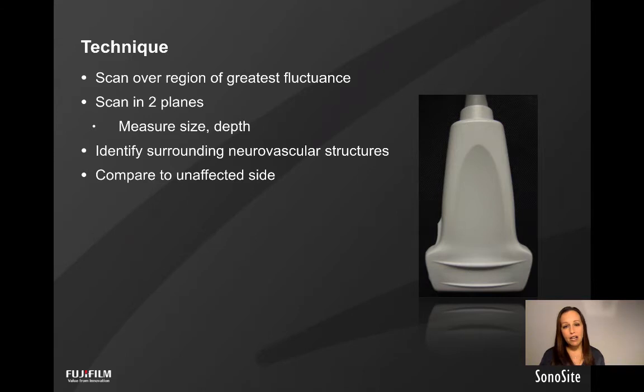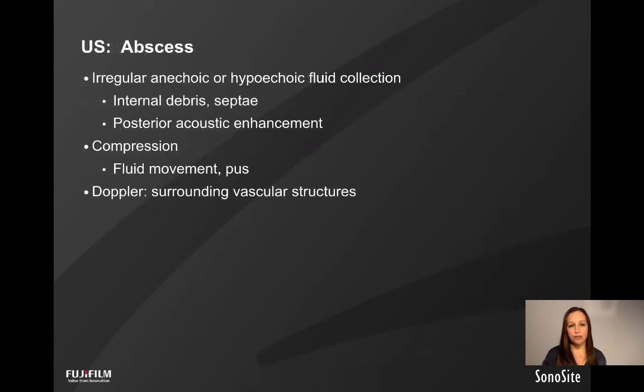Now, once you find an abscess, it's important to measure not only the size, but the depth if you are to perform an incision and drainage. And as I mentioned, it's important to identify surrounding neurovascular structures in order to avoid those if you are to perform an incision and drainage.